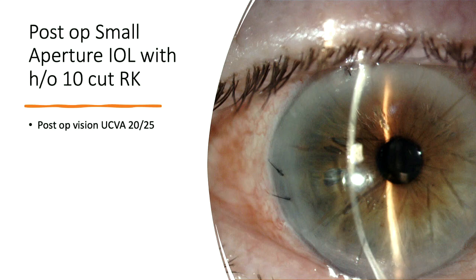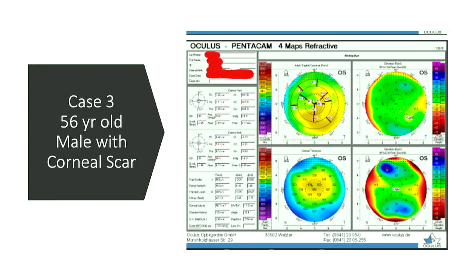This patient's post-op vision with a 10-cut RK was 20/25, and that's uncorrected.